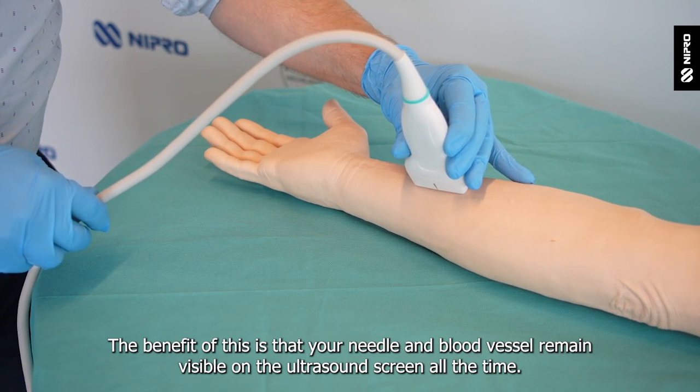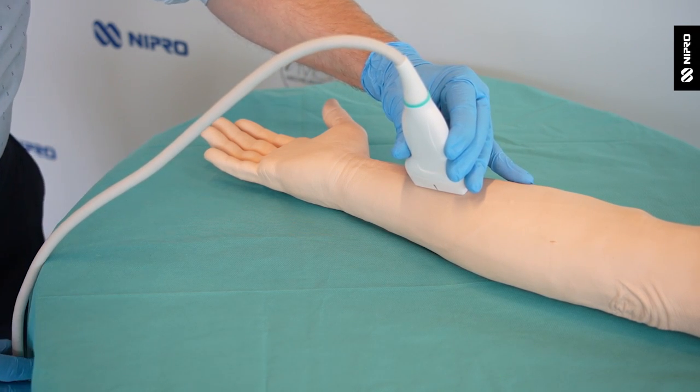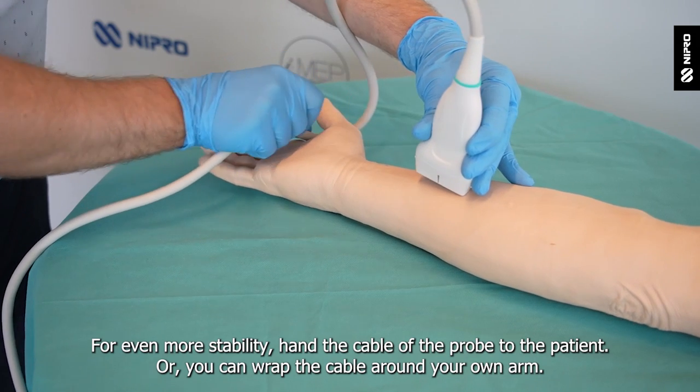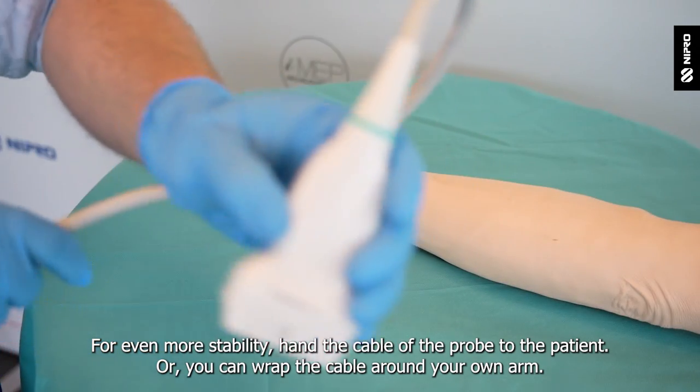The benefit of this is that your needle and blood vessel remain visible on the ultrasound screen all the time. For even more stability, hand the cable of the probe to the patient, or you can wrap the cable around your own arm.